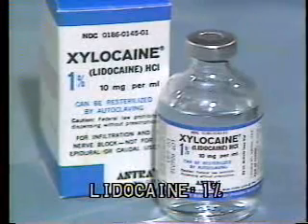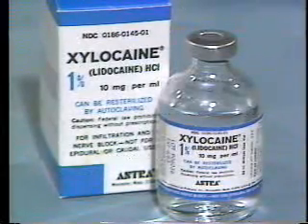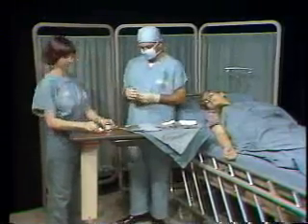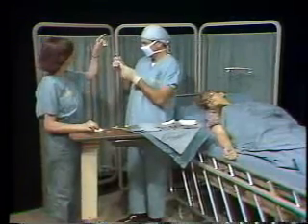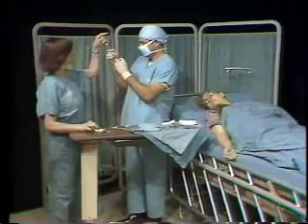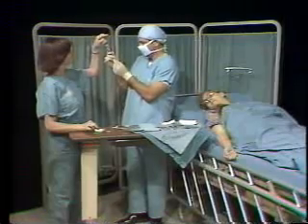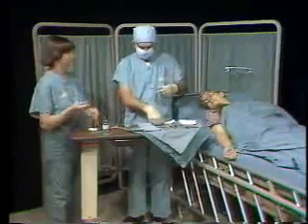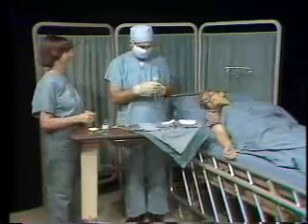Lidocaine is the most widely used local anesthetic. Remember these guidelines when using lidocaine. The recommended concentration is 1% for infiltration. The time of onset is 3 to 10 minutes. The effects last approximately 3 hours, and the maximum dosage is 300 milligrams or 7 milligrams per kilogram of body weight. An 18-gauge needle is used for drawing up lidocaine. A 25 to 30 gauge 1-inch needle is used for the actual injection. The amount usually does not exceed 5 cc's, so the 5 cc syringe included in most suture sets will be adequate.